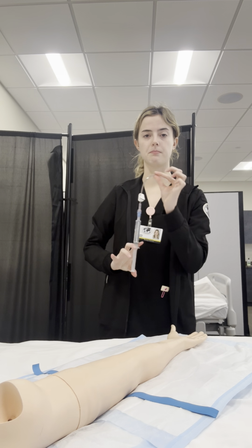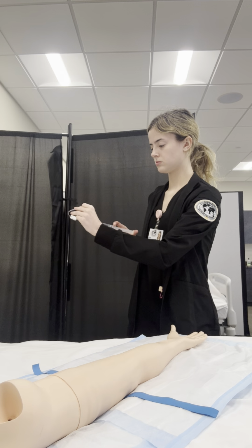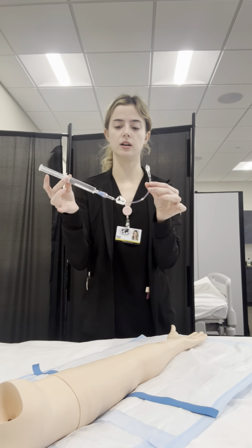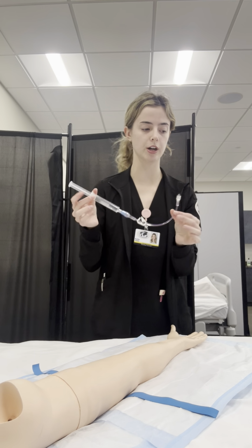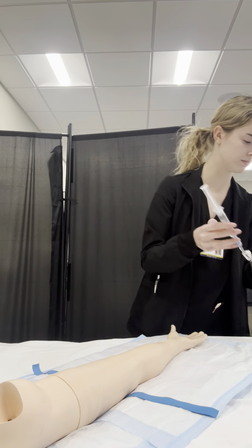And then I'm going to prime my extension tubing. Okay. So this is all ready to go. No air bubbles. Saline is flowing through the tube. Good. So I'm going to lay this back down on the packaging, ensuring that it doesn't touch the table.